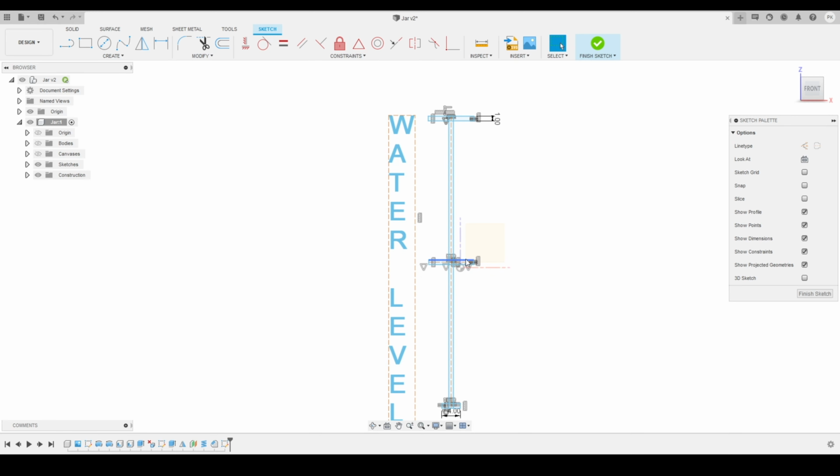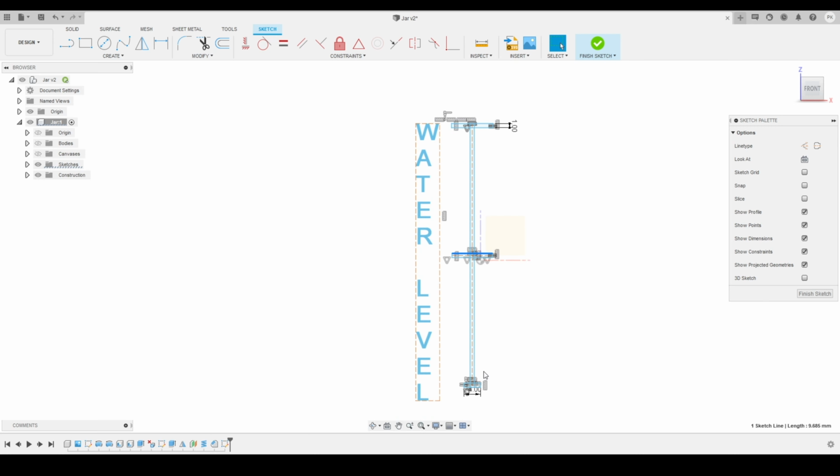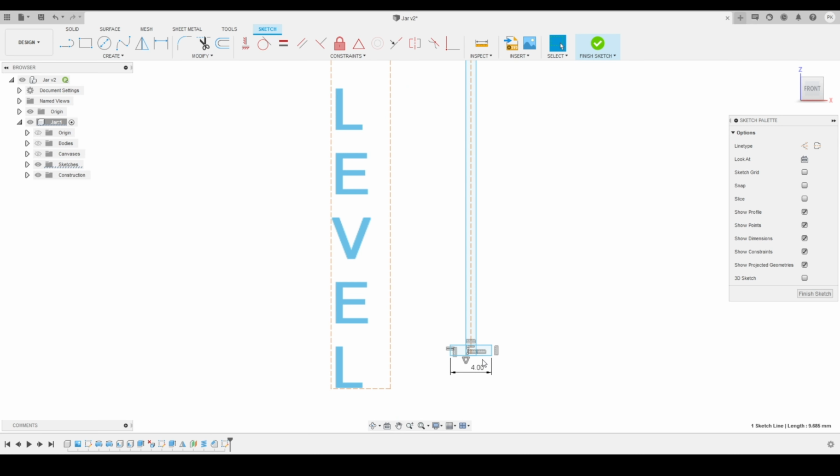And now what I will do, I will adjust this line a little bit just by dragging it, and we'll make sure that these are on the same level, and we'll make sure that these three sides are equal. So we'll select all these three sides and we'll apply the equal constraint like this. Here you can see.